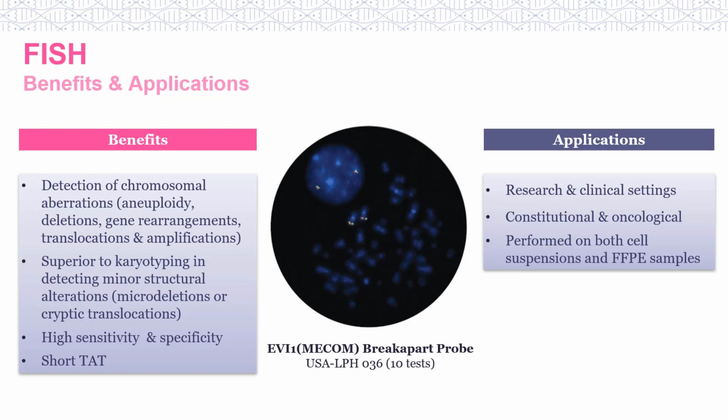FISH's high sensitivity, specificity, and short turnaround time have made it an essential technique for any cytogenetic laboratory. Furthermore, the FISH assay can be used in many applications, for both the research and clinical settings, oncological and constitutional testing, and is performed on a variety of specimen types, including cell suspension and FFPE samples, which is the reason it has become such a routine assay in labs around the world.